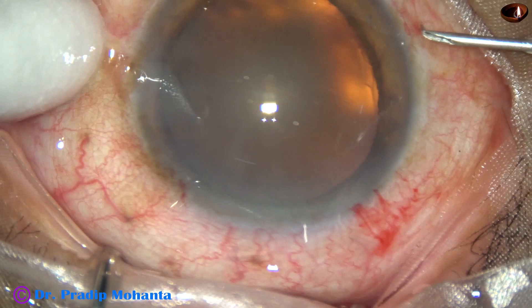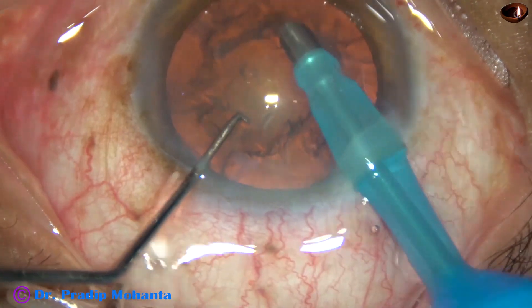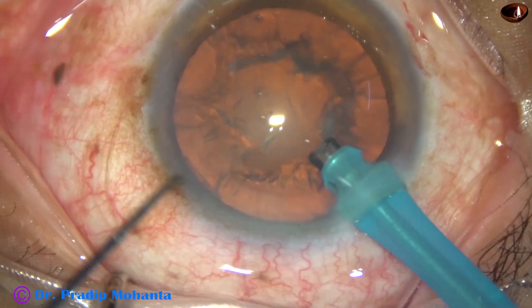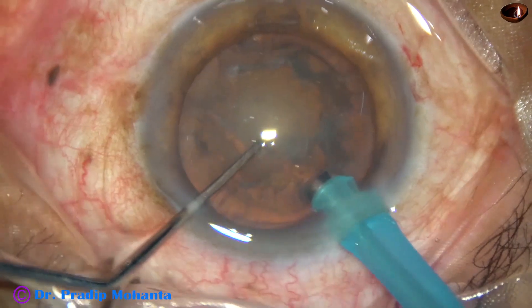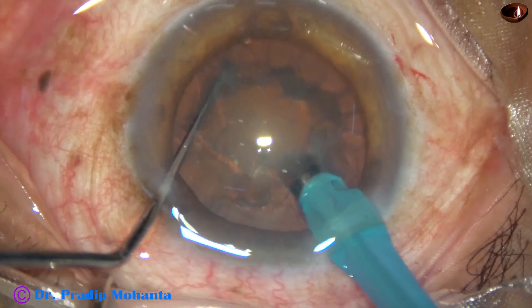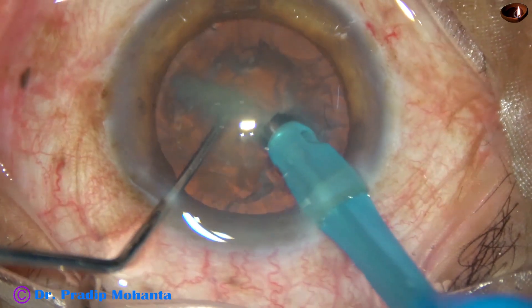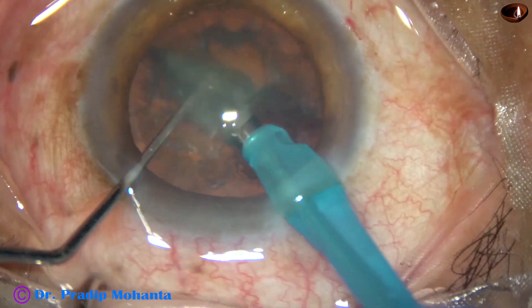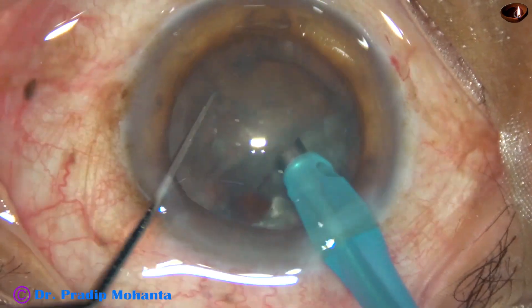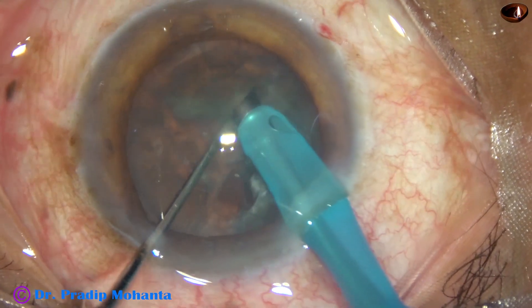This is the third case. Nucleus sclerosis in this case is again about grade 2 or between grade 1 and grade 2. Some superficial cortical lens matter has been removed. In the same way, a small pit has been made. The lens matter in front is supported by the FACO needle in irrigation, and the lens matter is chopped by the chopper. The chopper comes from the equator to the tip of the FACO needle.